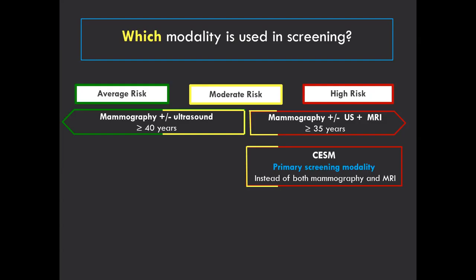Because why do a mammogram and then prefer the patient to perform an MRI examination when we can get the same results from one examination? But up till now, due to insufficient data, contrast mammography is usually used in the diagnostic workup of recalled patients from the screening programs, and it might sometimes be recommended for the follow-up of some patients, and we will see some applied examples.